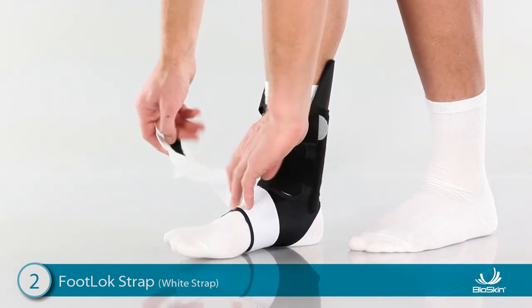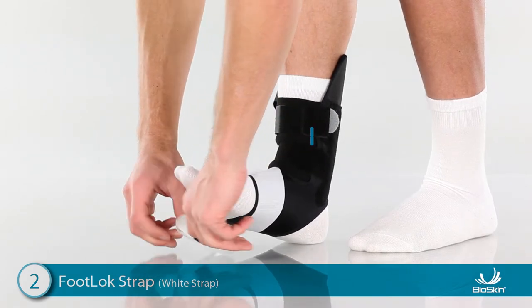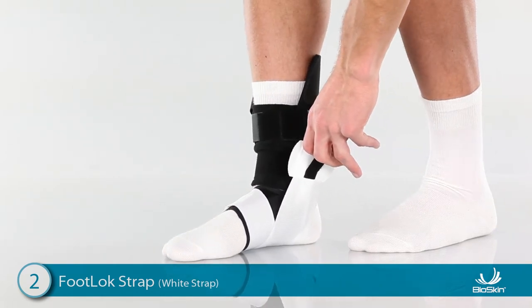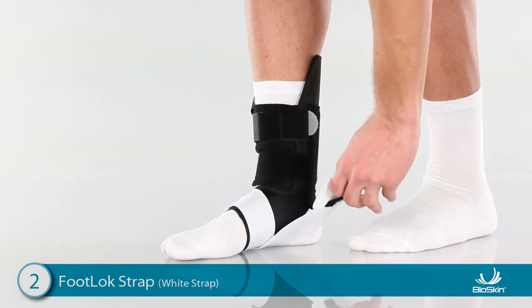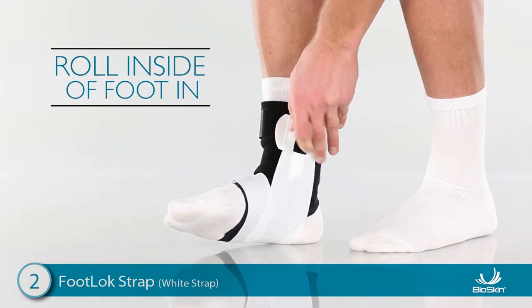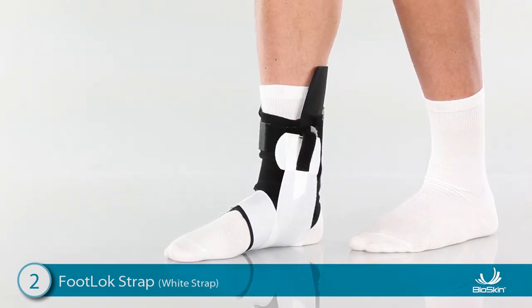To complete this step, wrap the footlock strap underneath the foot again. Position the foot at a 90-degree angle and pull the strap up with a finger loop and attach high on the inside of the ankle. For increased support, lift the toes up and roll the inside of the foot in as you attach the footlock strap. The footlock strap is now mimicking the ligaments and tendons supporting the arch.